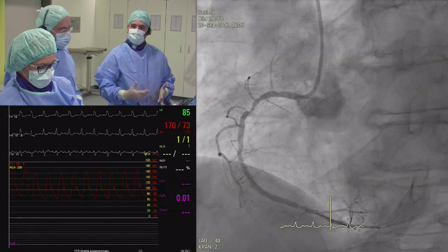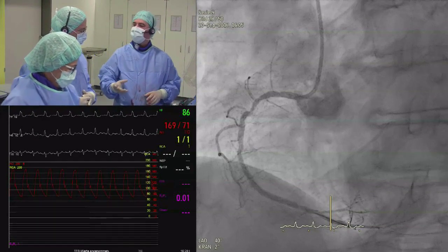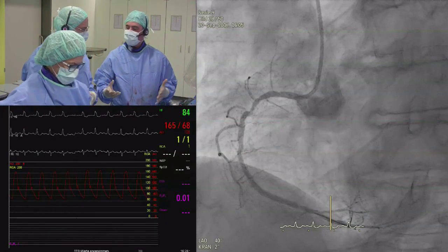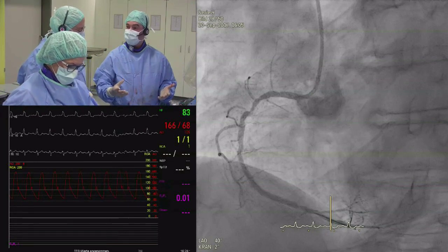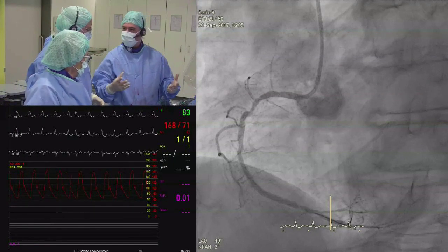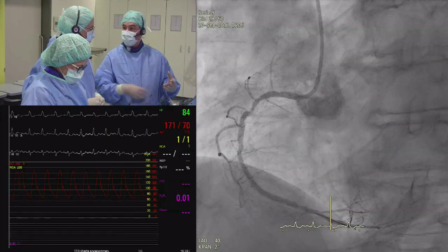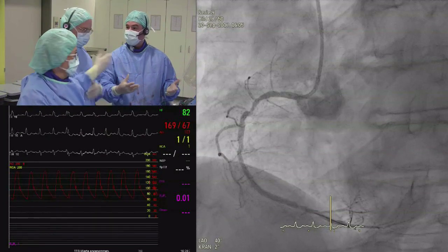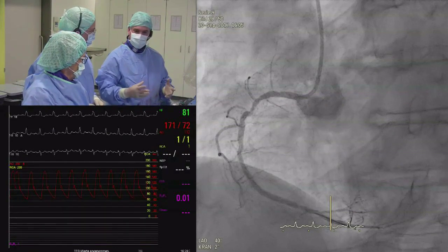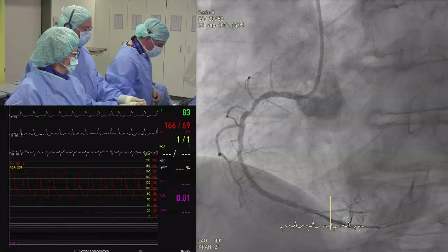But in my experience, if we now have more and more patients treated in heart teams, and you do FFR also in patients who are prone to CABG, it often changes the perspective, because surgeons normally tend to put a bypass on every diseased vessel at the end of the day, and then you end up with very good flow in the non-hemodynamically diseased vessel, and that speeds up the proximal portion. So I think even if we go for a surgical approach, hemodynamic measurement still makes a big difference.